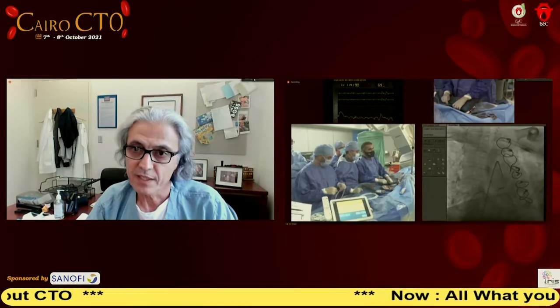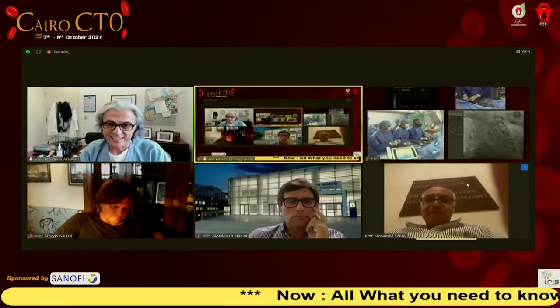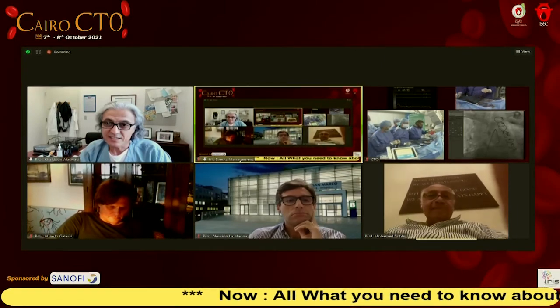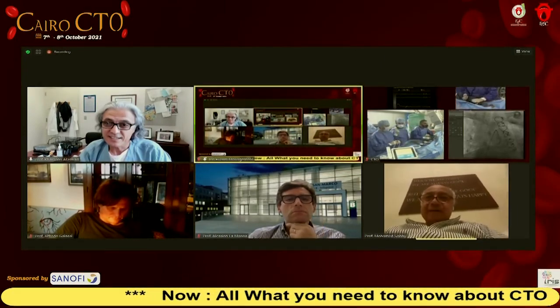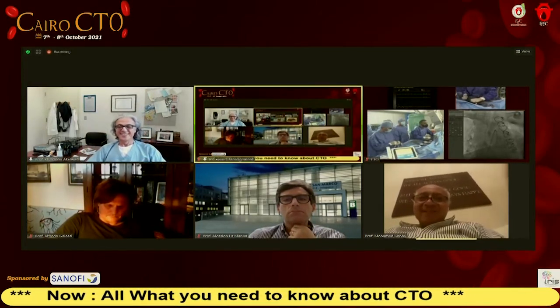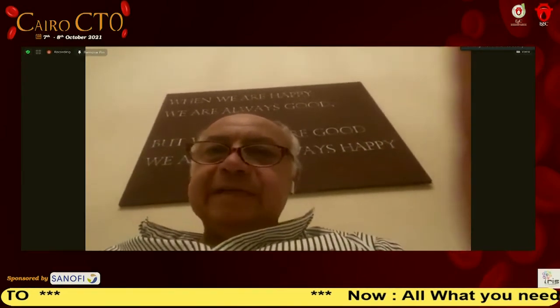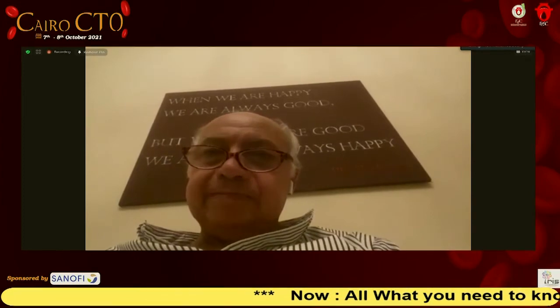Okay. Khaldun, thank you very much for this nice talk, as Mohammed Safi is speaking to. Khaldun is now the head of the Henry Ford Institute, where I was in 1984, just as a fellow, when I started my career in PTCA with Kaja at that time. It's 38 years ago. Khaldun, regarding the IVUS, it should not be routine in CTO. So I'll give you my philosophy. It should be used in zero contrast patient CTO.